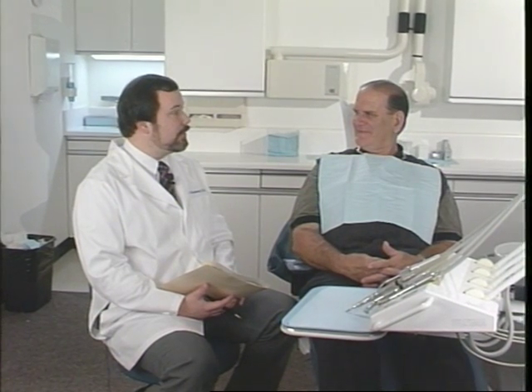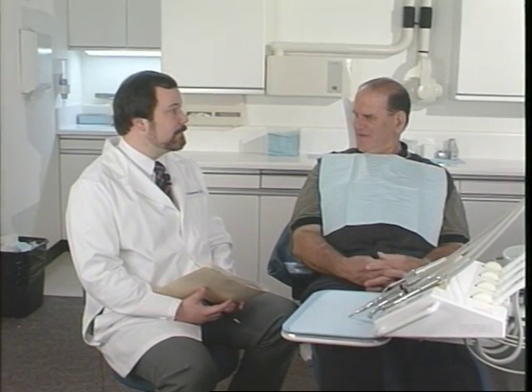Robert, I know you're here for new dentures, but I need to ask you a few questions about your old ones. Sure. How long have you been wearing your present dentures? About 40 years. What would you like to change most about your dentures? Well, my daughter brought up the point that when I smile, you can't see my teeth. And I don't know if that's the dentures or not, but I think it probably is.